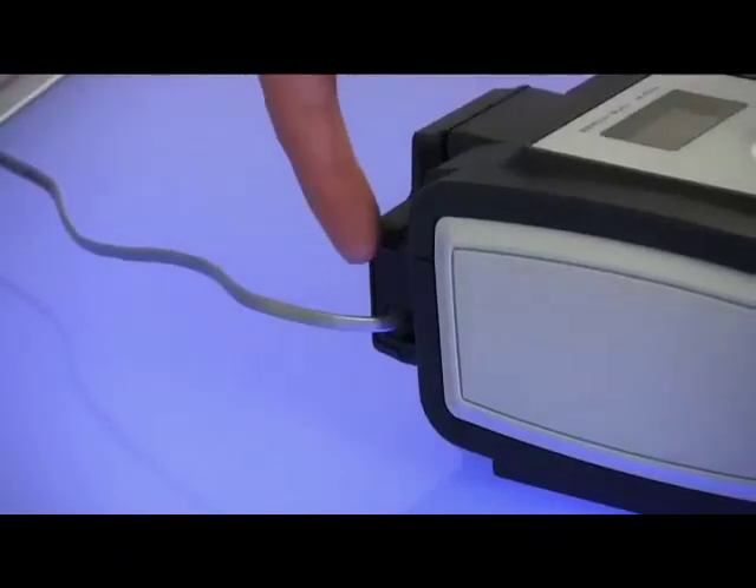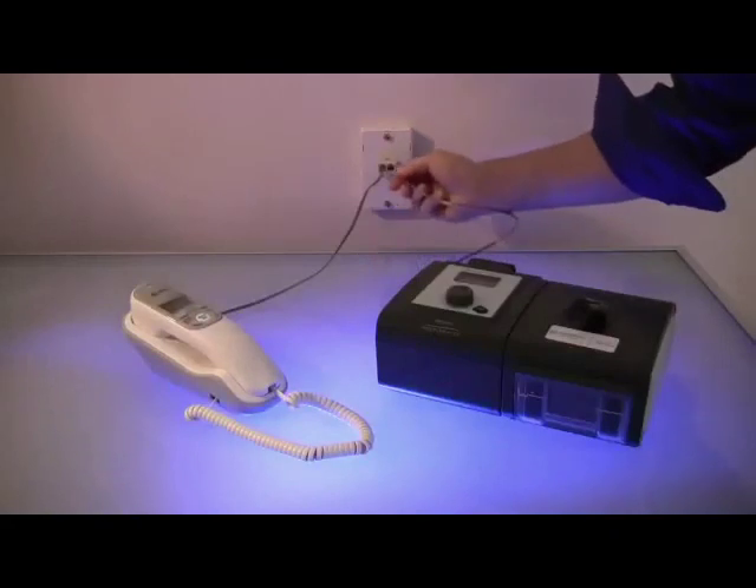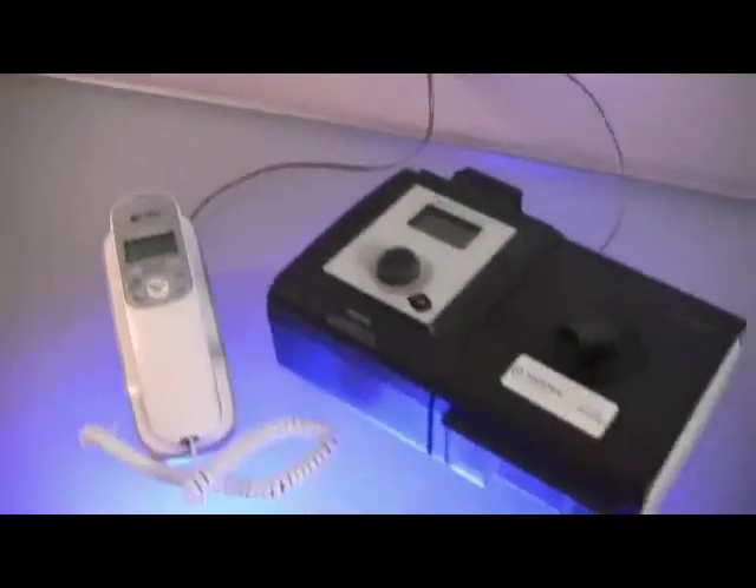If the modem's line is not connected on the side of the modem module, insert it now. Plug your CPAP modem line into the open phone jack. You may now place the CPAP machine and phone near your bed.